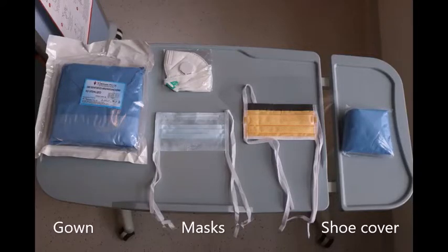After performing hand hygiene, we have to wear different components of PPE outside the patient room. The different components of PPE are shown in the image. Wear the PPE in the same order as demonstrated in the video.